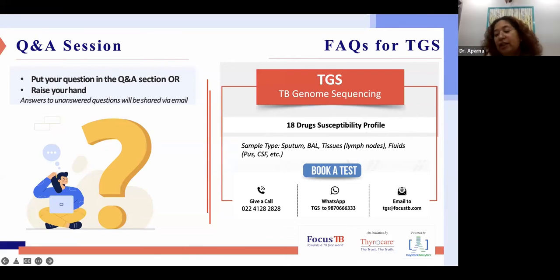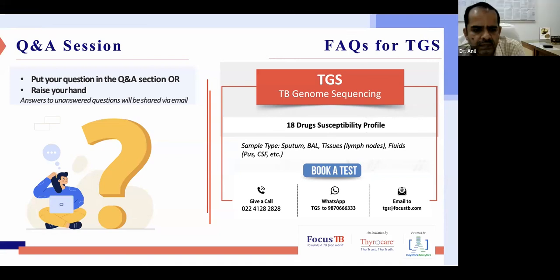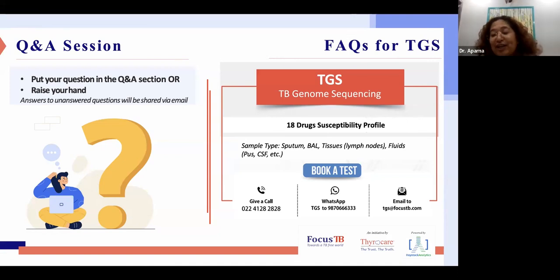That is a very interesting thing, because, like you said, bioinformatics is a very critical aspect when you're doing a whole genome analysis. You have a bioinformatics pipeline which determines whether it is Mycobacterium other than tuberculosis. The next step you suggest is very interesting: that the pipeline should also be able to identify the drug resistance or drug sensitivity of NTMs, which could be a good initiative for us also at Haystack, and to take it ahead.